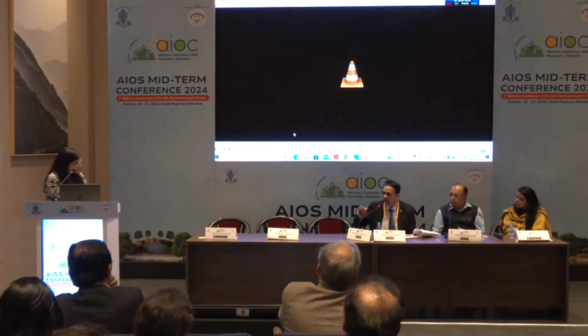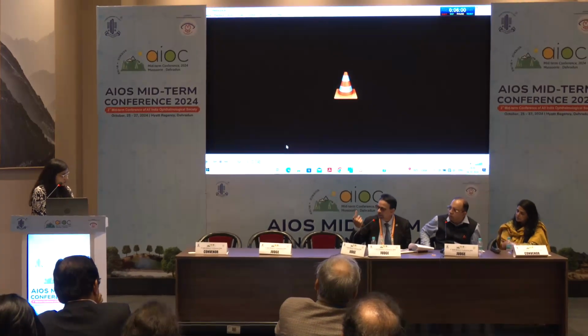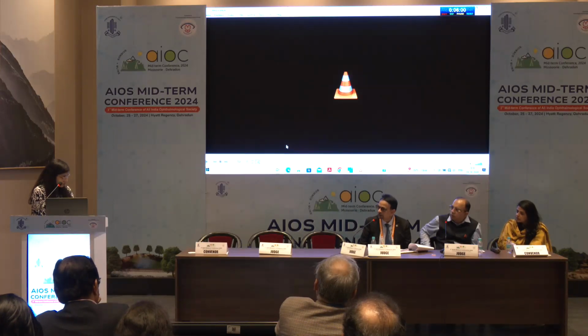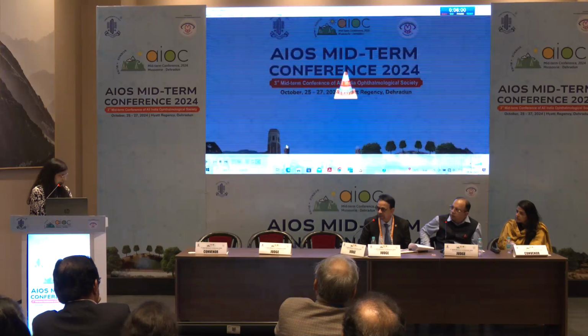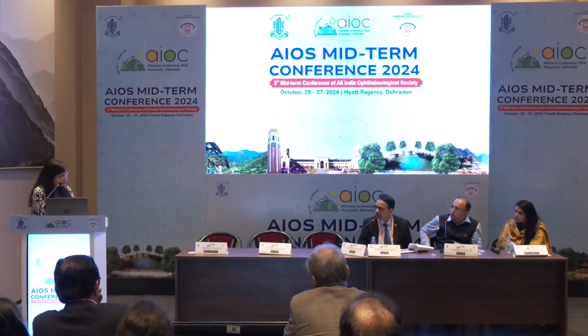Very nice. I've done this for patients who have high myopia. Only thing is, I don't go with the MVR knife through the iris because sometimes you can produce an iridodialysis. So what I do is, with a cutter, I make a small iridectomy and then go through that, bring that haptic through and externalize it. That can be done. The only problem is because you are a little anterior, there is a possibility of pupillary capture. Have you noticed anything like that?